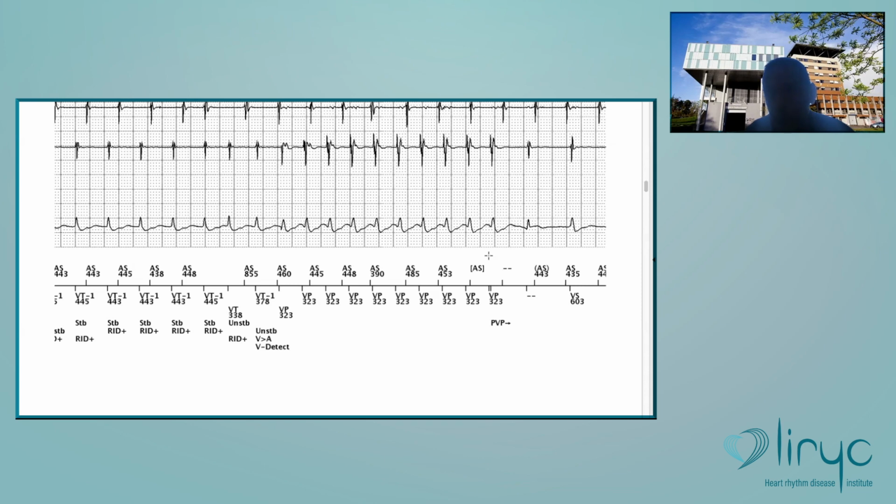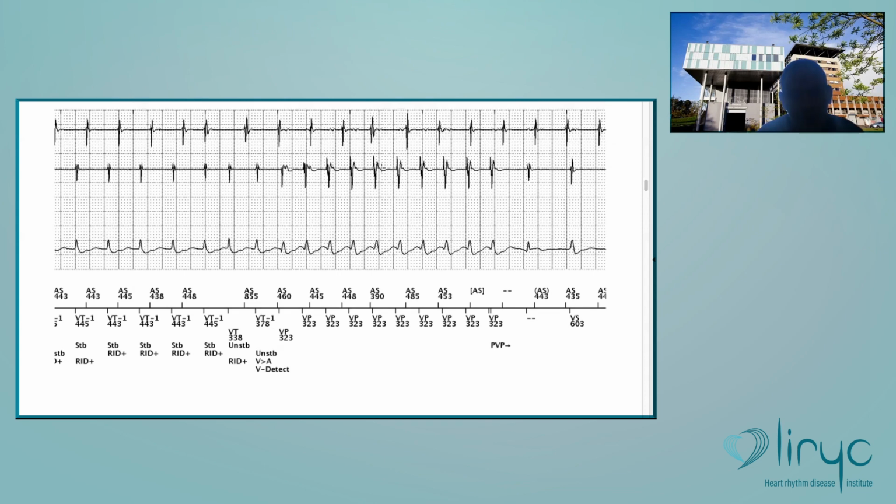For example, with atrial undersensing in an episode of atrial fibrillation, you will treat everything, you understand? Here the quality of sensing is correct, but the premature atrial contraction is a problem because it's just at the time of the blanking. If because of refractory periods you have functional undersensing, then you will also receive inappropriate therapy.